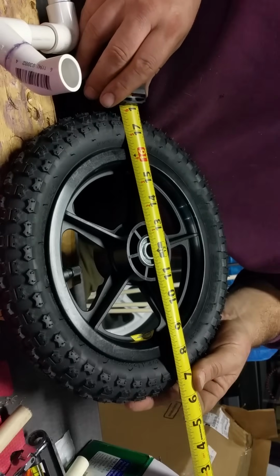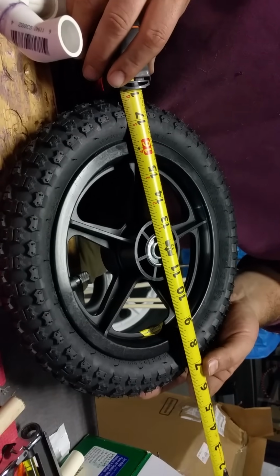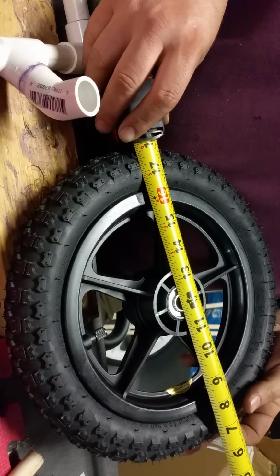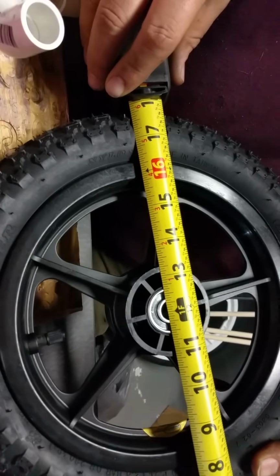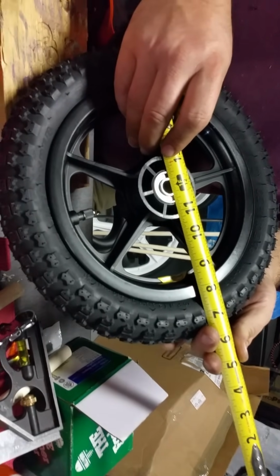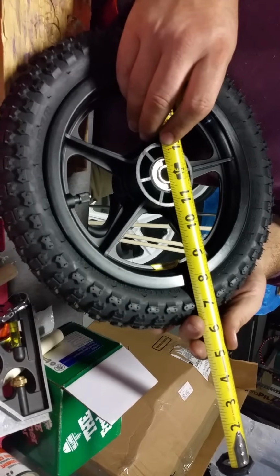So the way we like to do it is to set the tape measure at the cart height at the edge of the wheel. If we go to the center of the hub, this shows us that the hub is at 12 inches. This cart is going to need a second support in the back. It's going to have 2 bars in the back.